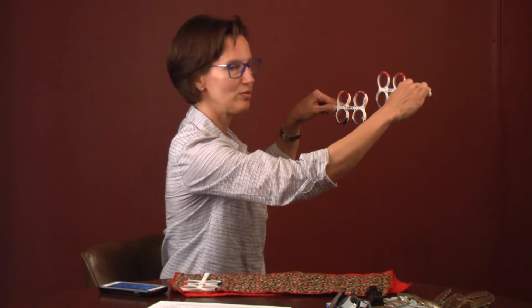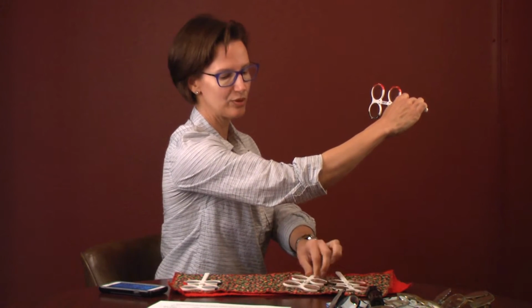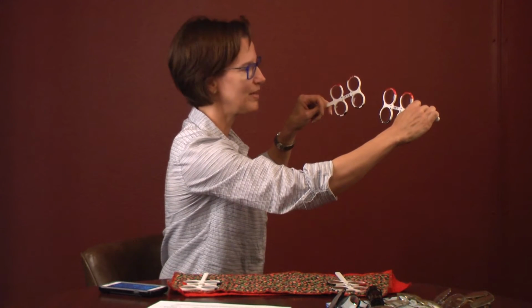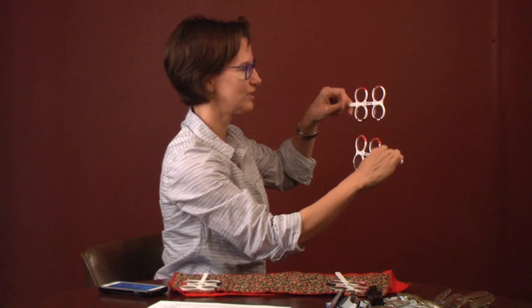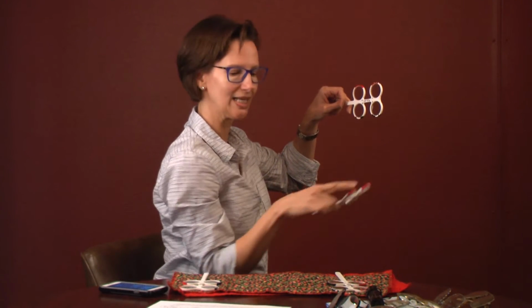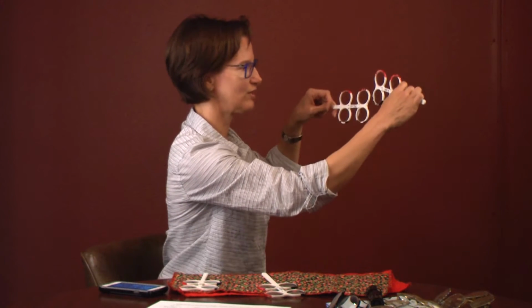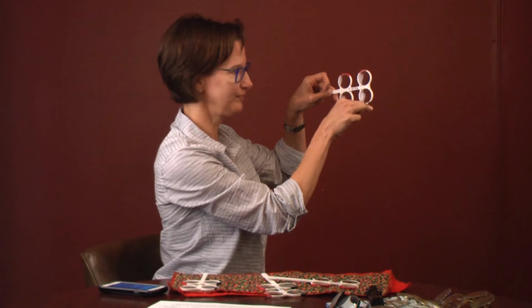If they like the 2 better, you're going to hold that 2 up there. You're going to lay those other flippers down. I'm going to separate them, and now I've got the plus 3 side. So I'm going to compare the plus 2 to the plus 3, plus 2, plus 3. If they like the 3, we're just going to keep going up. Then you'll compare the 3 to the 4, 3 to the 4. Let's say they don't like the 4 and they like the plus 3 better.